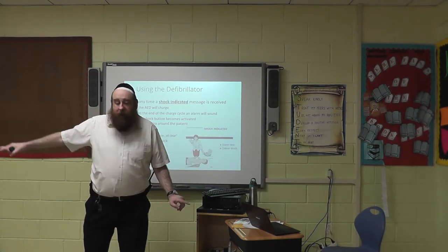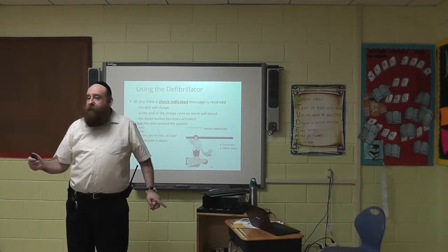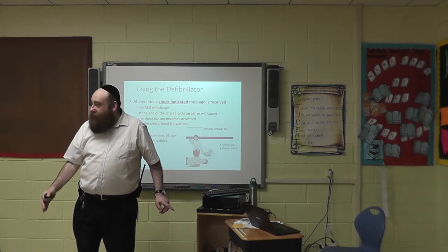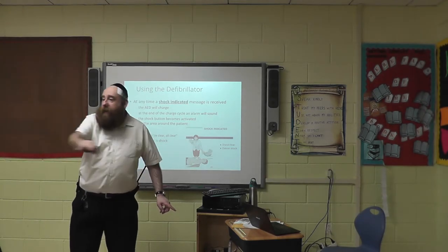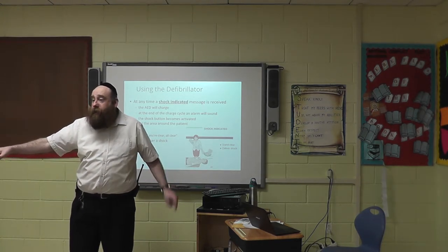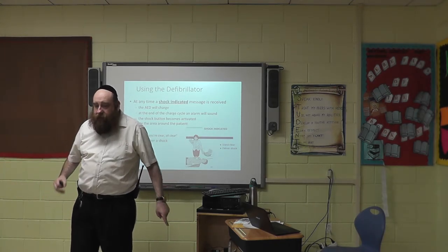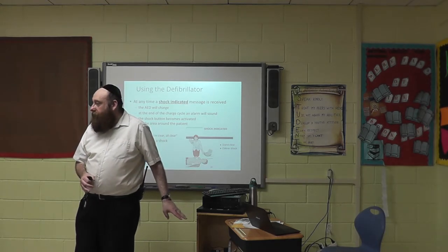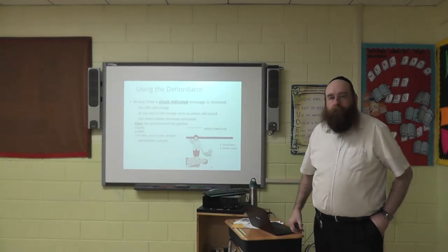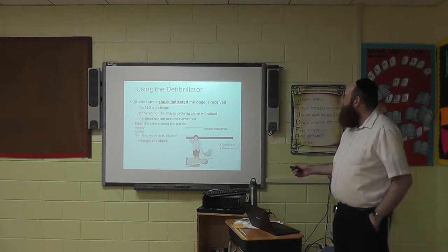Good, now I'm ready. Now I clear the scene, make sure there's no family members, no orderlies, no nurses, get everybody away, and you say, I'm clear, you're clear, we're all clear, shock. And I always look at the patient, never at the machine. The machine knows what it's doing. How long should that take you? A few seconds. See? She's doing good. I like that.